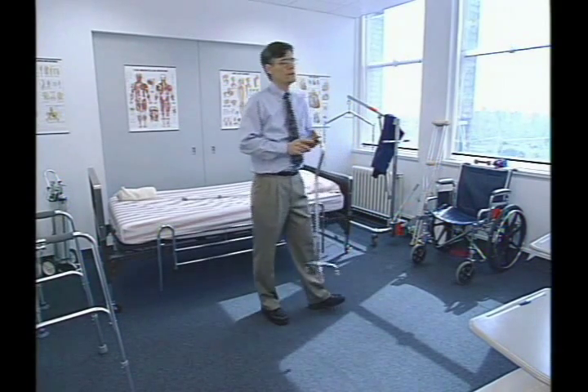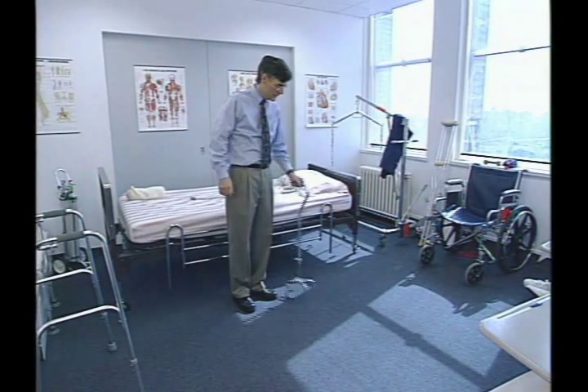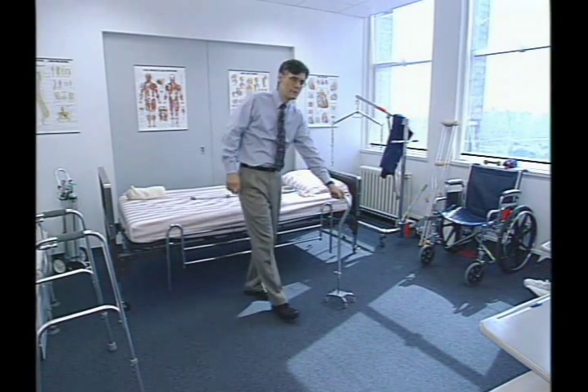In order for this to give good support, it has to be positioned correctly. You don't want the cane to be way out in front of the foot.